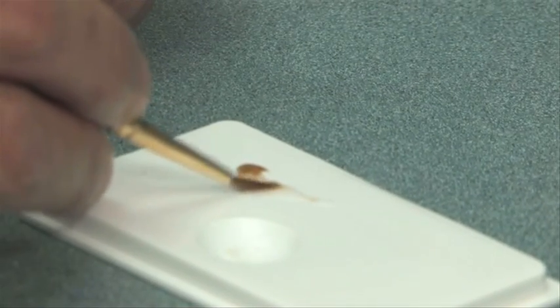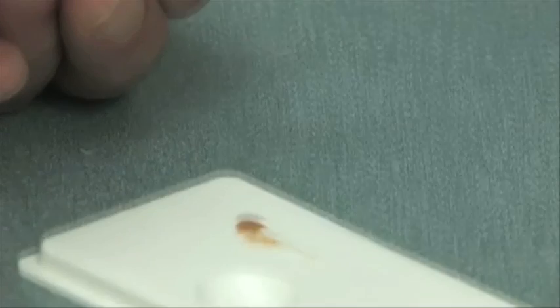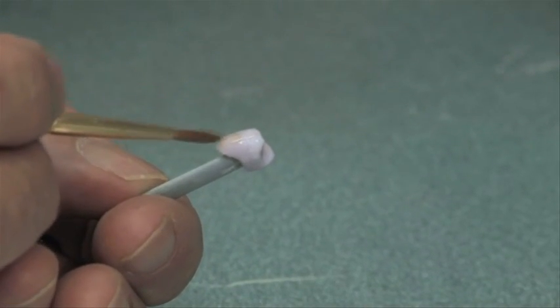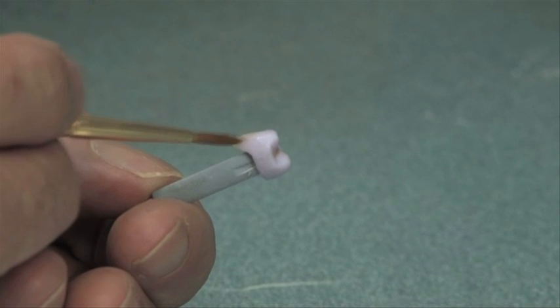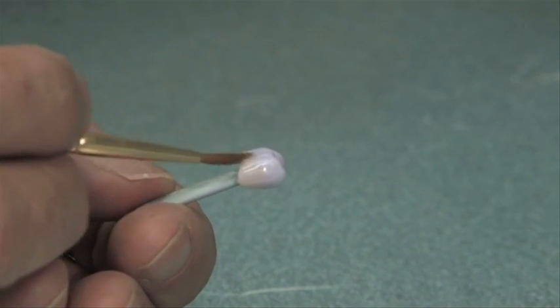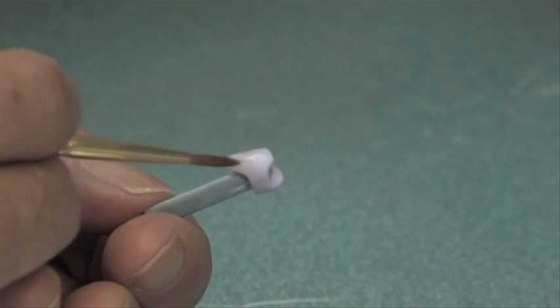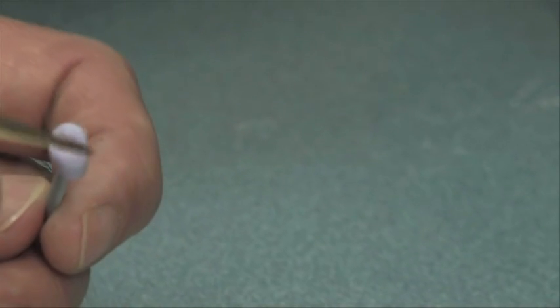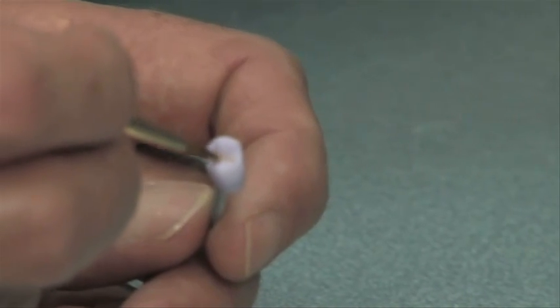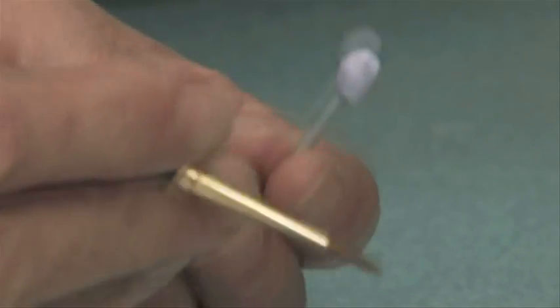We finished placing the glaze on the crown and now we're going to add just a little bit of coloration, or what we call stain, at the cervical or gum line area to mimic the natural coloration of a tooth as it gets a little bit darker close to the gum line. We'll place just a little bit in the central groove to make that look natural.